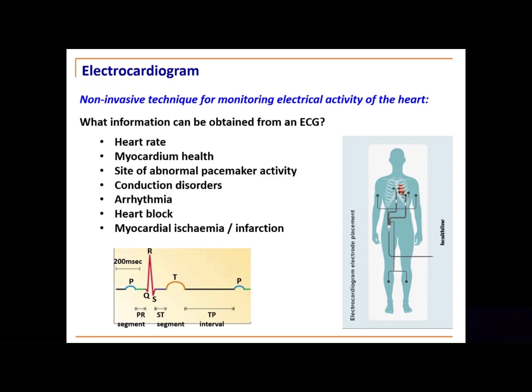Have we got arrhythmias? So the heartbeat going out of sync. And do we have heart block? Have we got myocardial ischemia or a myocardial infarction? So you'd be thinking about a heart attack. These can all be detected very nicely in an ECG.